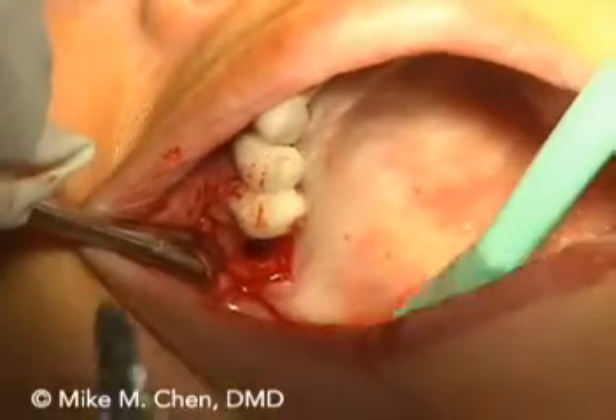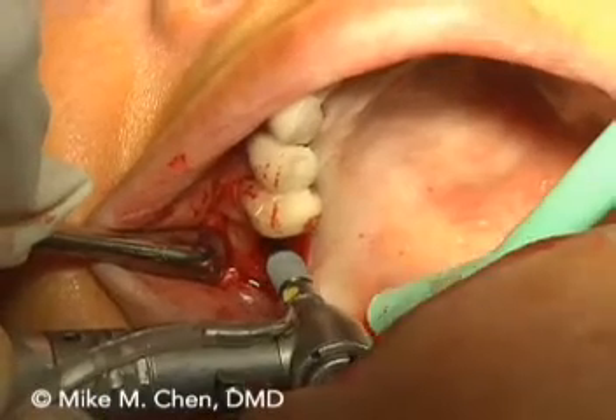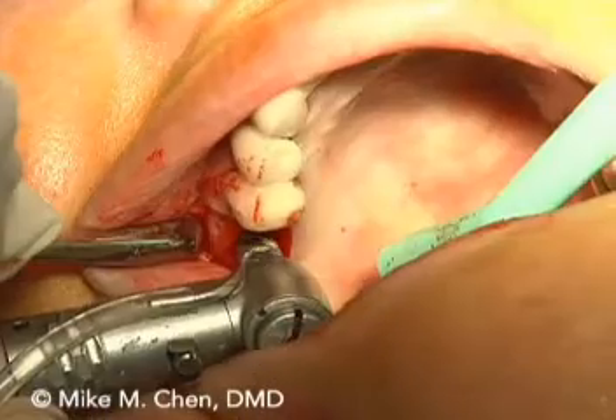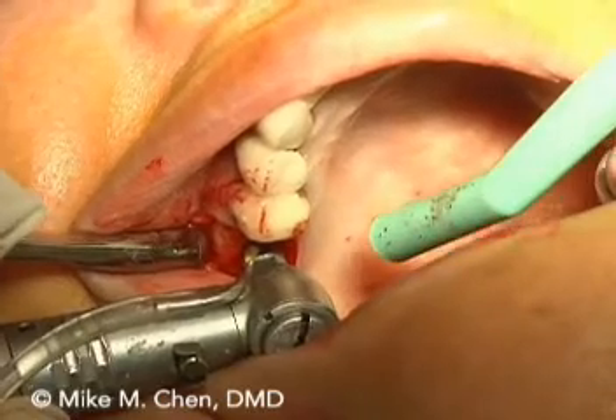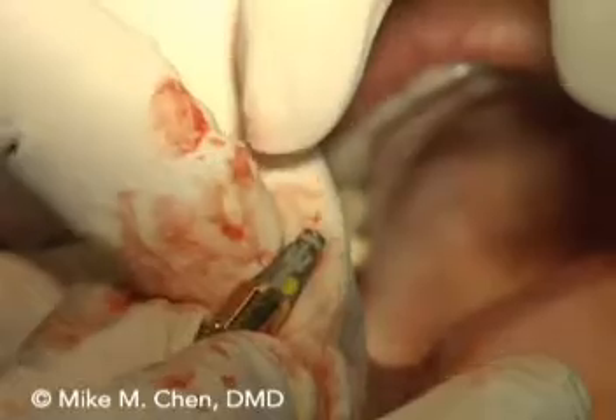See how much room there is — very nice. Go ahead and place it in. It's a 4.3 by 10. Okay, stop. Let's take it out.